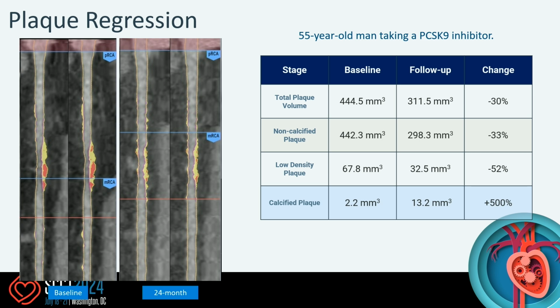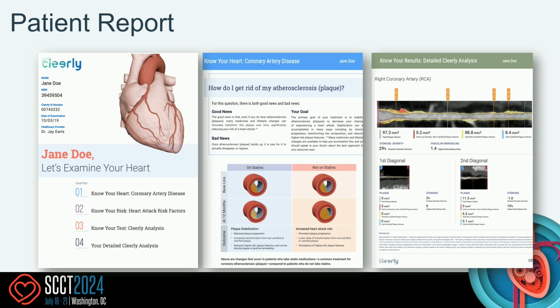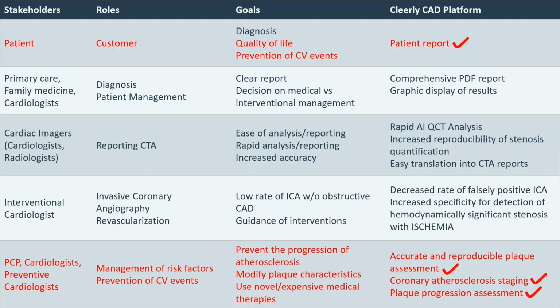Of course, the plaque data need to be transformed into usable reports, whether on the physician side or, more importantly, on the patient side, so we can get the most important change, and that's the change to quality of life and prevention of cardiovascular events for individual patients.